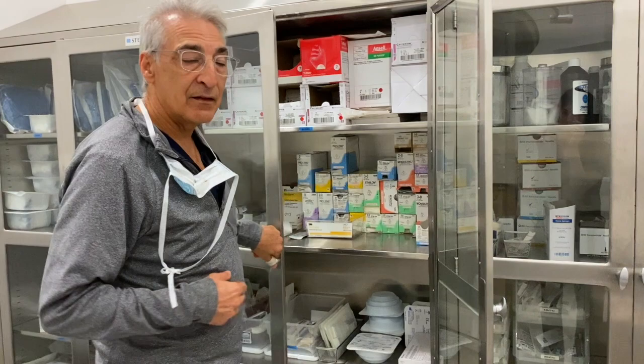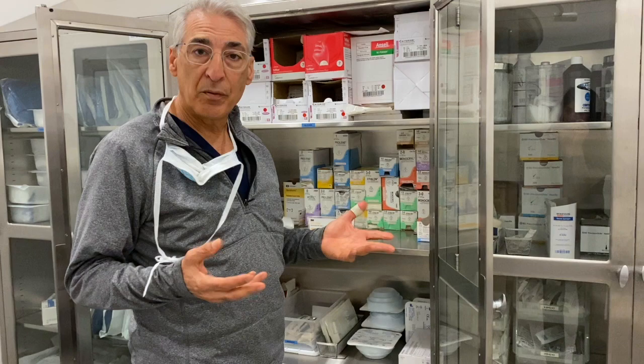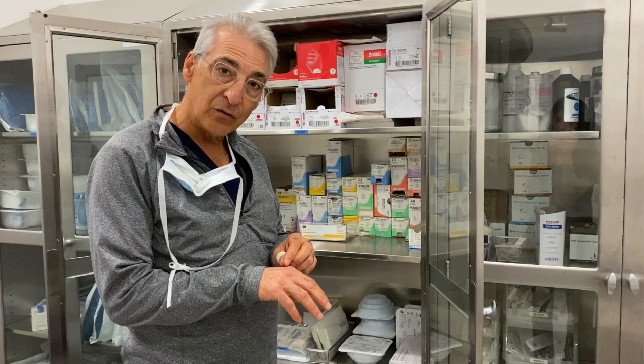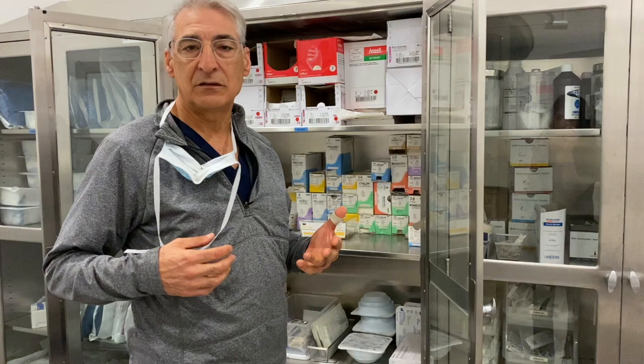Underneath, if you're sewing a hernia for example, where you need strength for a long time, you want permanent suture material. Where would you want absorbable suture material? Well, in the skin, if you want a suture to fall out by itself, you want an absorbable suture. Under the skin, in the deeper tissues, you want absorbable suture material when you want it to go away after a few weeks.